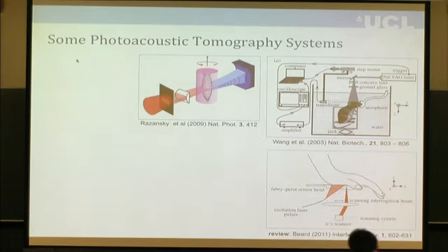This is a cartoon of a system we use at UCL. So here we measure over, this is the detecting region, just a small piece of a plane. And I'll come back to this system later, but we measure points on this. This is an array, essentially, a planar array.